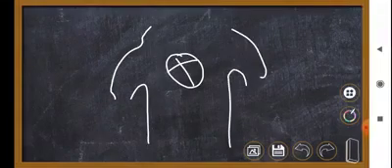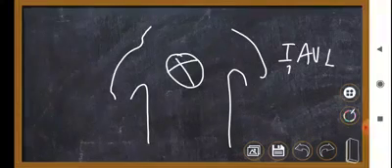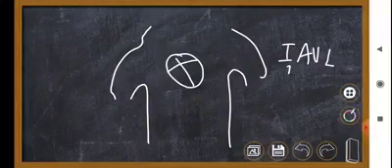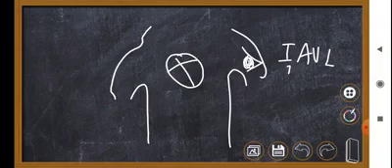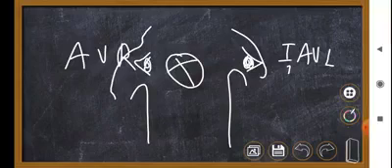So simply speaking, suppose this is a heart and this is the person whose ECG is being performed. Lead 1 and lead AVL look at the heart, or the electrical changes occurring, from here, and suppose this is the eye. This eye corresponds to lead 1 and lead AVL, and lead AVR looks at the heart from this side.